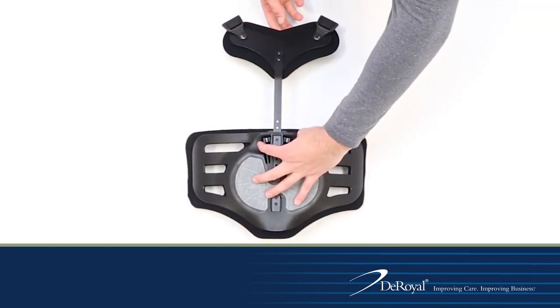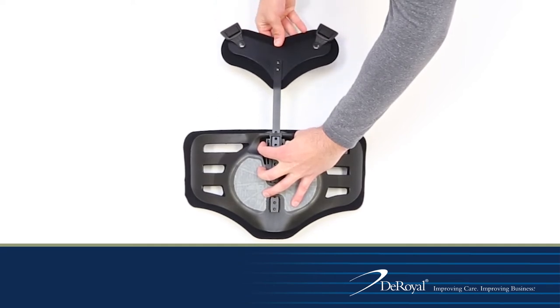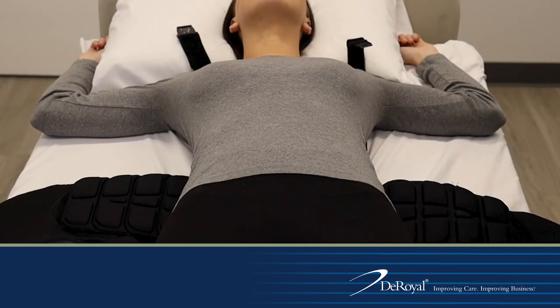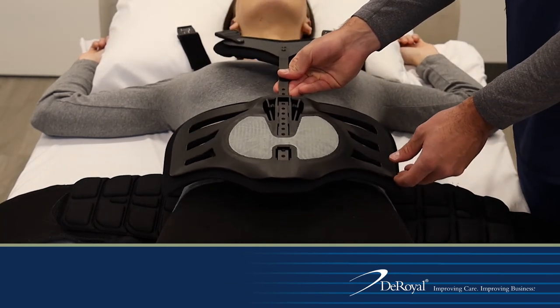Adjust the SPK by pinching the adjustment mechanism on the anterior panel and lowering the sternal pad. With the brace under the patient in supine position, retrieve the anterior panel and SPK and place it on the patient so the anterior panel is just above the pubic bone. Align the sternal pad to approximately 3 to 4 inches below the sternal notch.